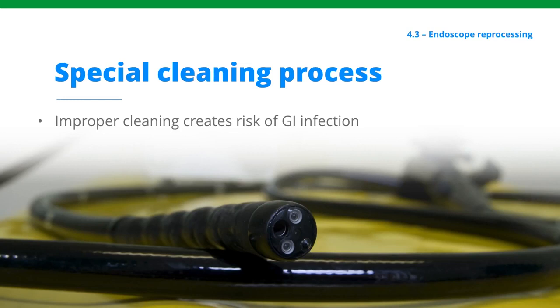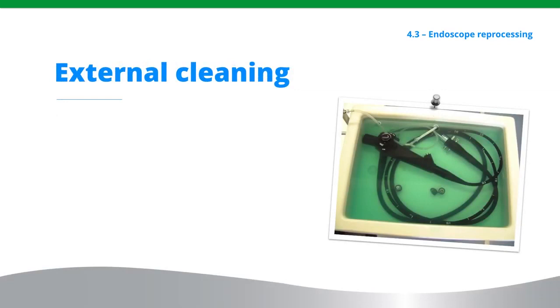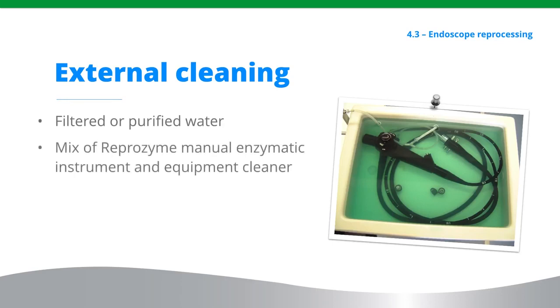Flexible endoscopes present special risks of damage if submitted to heat sterilization. The lens areas are particularly vulnerable. The repair bill for a heat-damaged scope can be so expensive that the risk is not worth it. Cold sterilization is therefore recommended. Start with a large bowl of filtered or purified water, with a mix of Reprozyme manual enzymatic instrument and equipment cleaner.